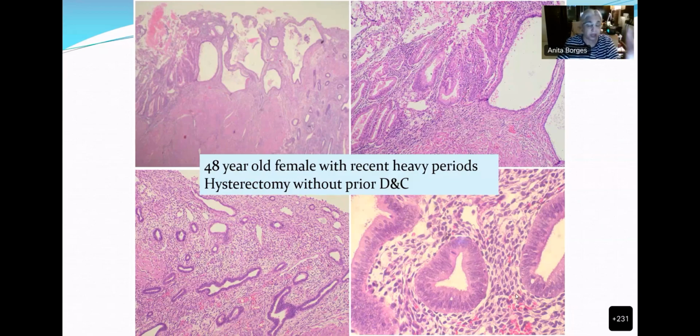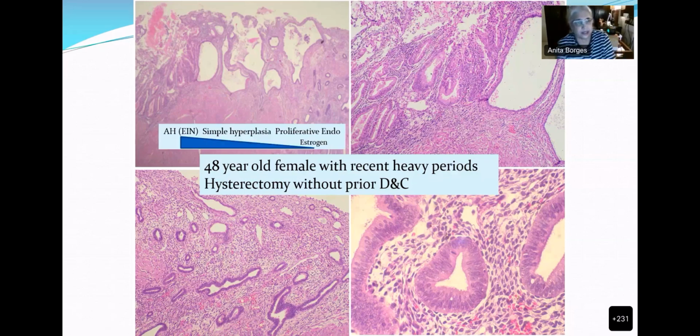So you have got, Mansi, an estrogenized endometrium. There is estrogen in the system because it is producing a proliferative phase. There is a cystic phase over here, which we call simple hyperplasia. Once upon a time, you need not use the term cystic glandular or whatever you want, but this is a cystic proliferation in this endometrium. And then what has happened? There are back-to-back glands. So you can see that there is atypical hyperplasia. You might want to call it endometrial intraepithelial neoplasia. I tend to use these terms interchangeably. Simple hyperplasia with cysts and a proliferative endometrium.